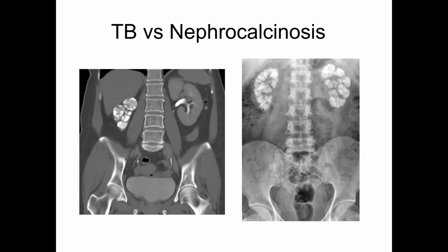Tuberculosis can affect any organ from head to toe. It can affect any organ. So it's one disease that can affect any organ anywhere. Understand? But remember, it is going to be small, entirely calcified, non-functional, and the appearance would be something like this. It would not have a typical cortical or medullary calcification. The reason for showing you this is how to differentiate it from medullary sponge kidney or medullary calcifications. Understand? Not to mix them up.